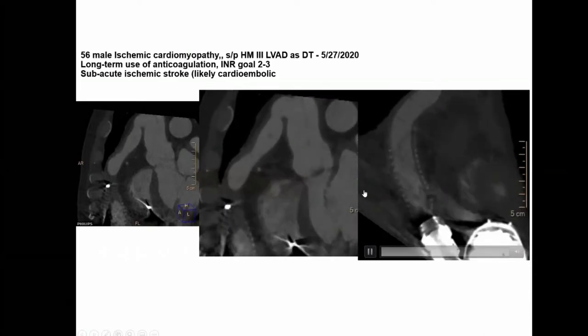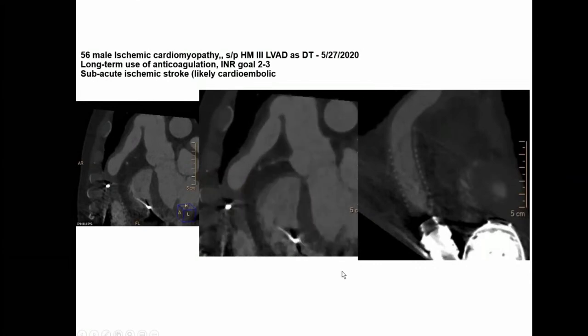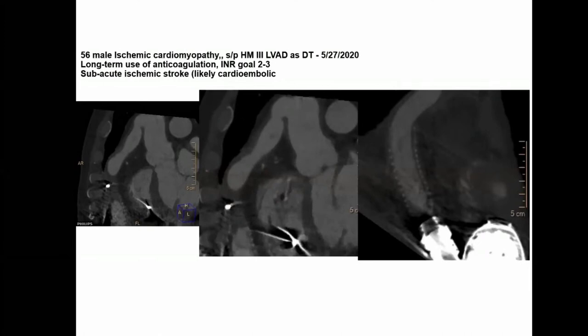It's not common, but we do see it occasionally. This just happened in a patient who had a history of stroke, but we do have cases where the patient is completely asymptomatic. Again, it's one of those cases where the powerful imaging allows you to see something, but it's up to us to find the clinical correlation of this abnormal finding.